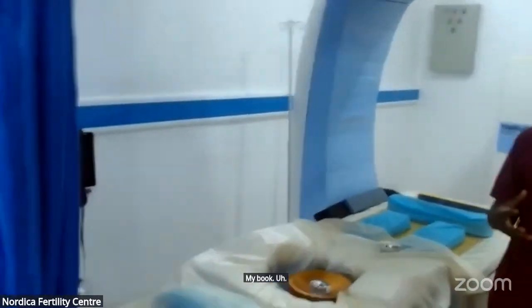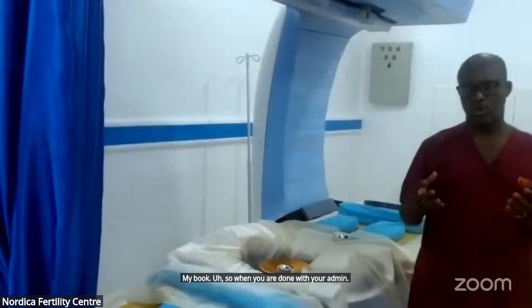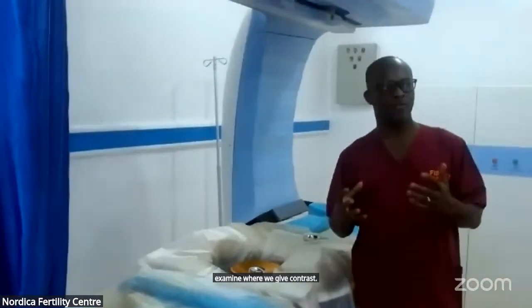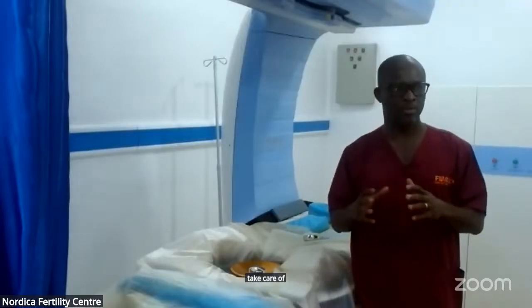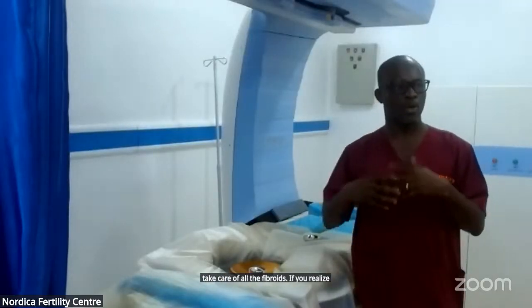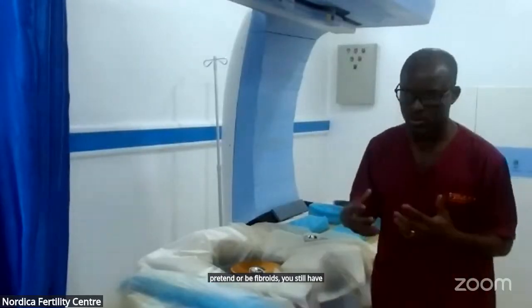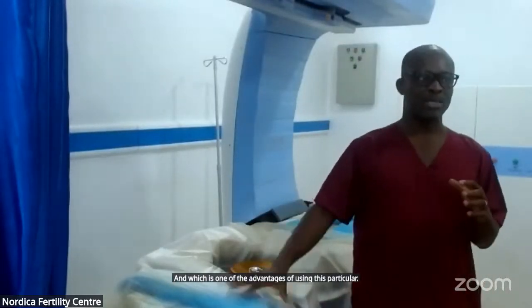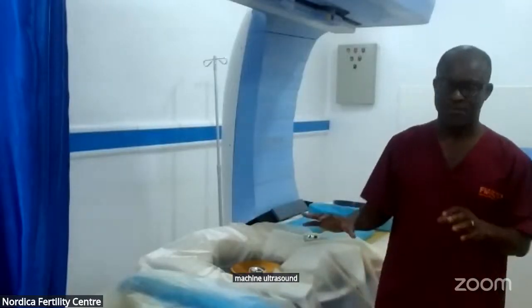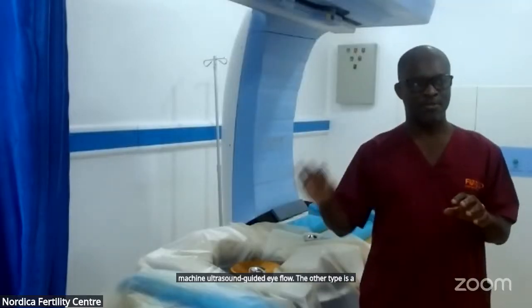When we are done with the HIFU treatment, we give contrast to confirm whether we've been able to take care of all the fibroids. If we realize that we've not treated all the fibroids, we still have the opportunity to continue the treatment, which is one of the advantages of this particular machine, the ultrasound guided HIFU. The other type is magnetic resonance HIFU.